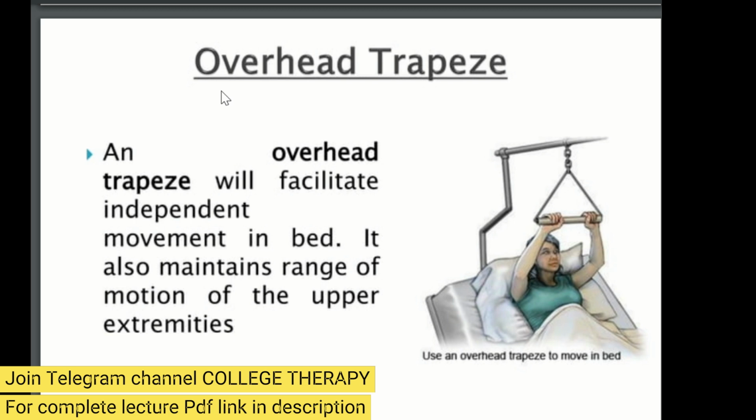Now this is the overhead trapeze. An overhead trapeze will facilitate independent movement in bed. It also maintains range of motion of the upper extremity.